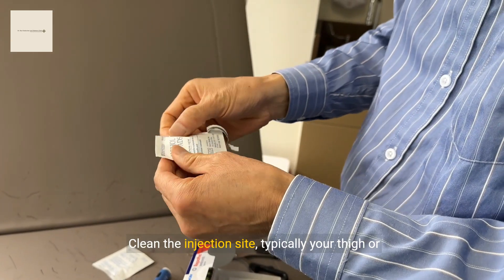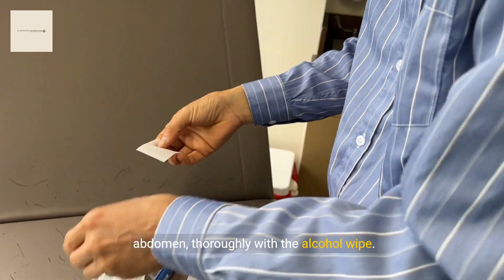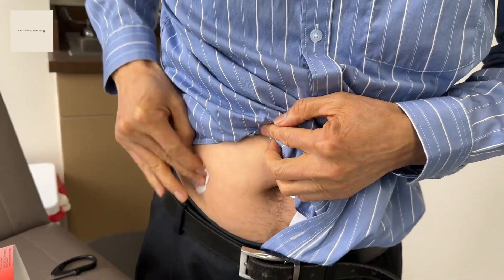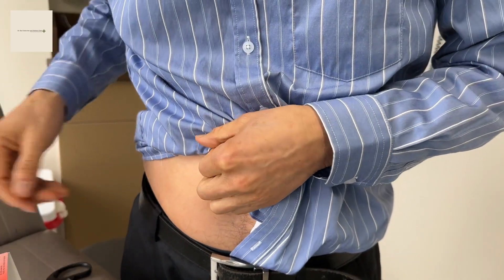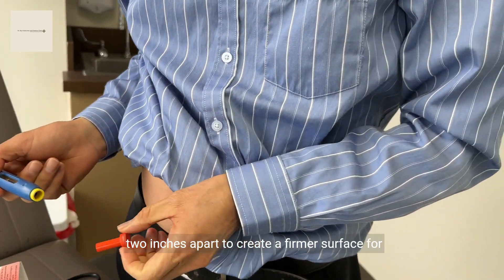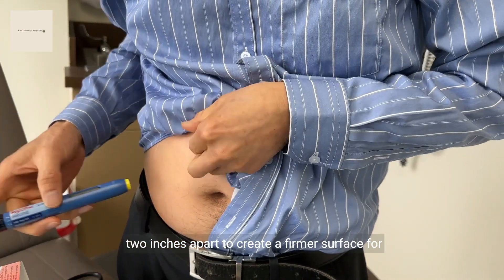Clean the injection site — typically your thigh or abdomen — thoroughly with the alcohol wipe. If you are thin, you can pinch your skin about 2 inches apart to create a firmer surface for injection.